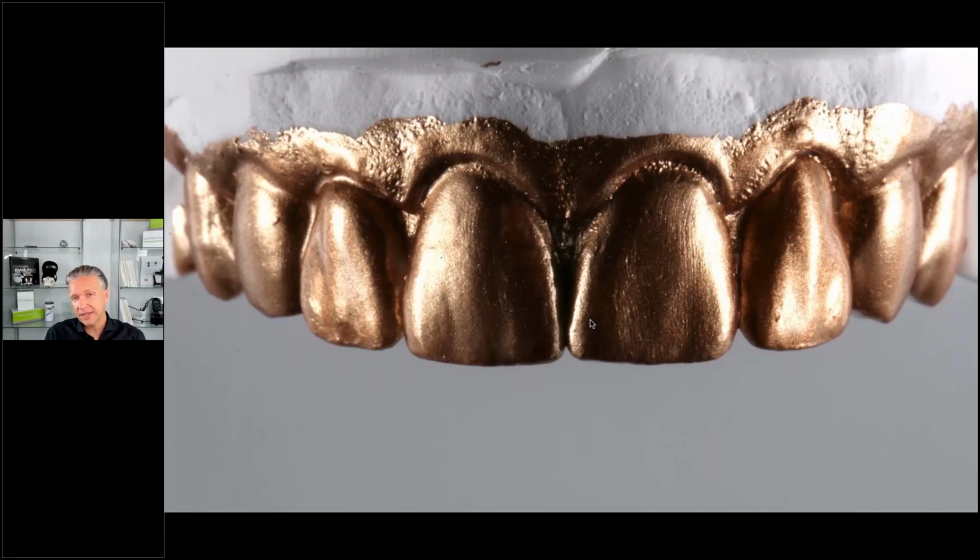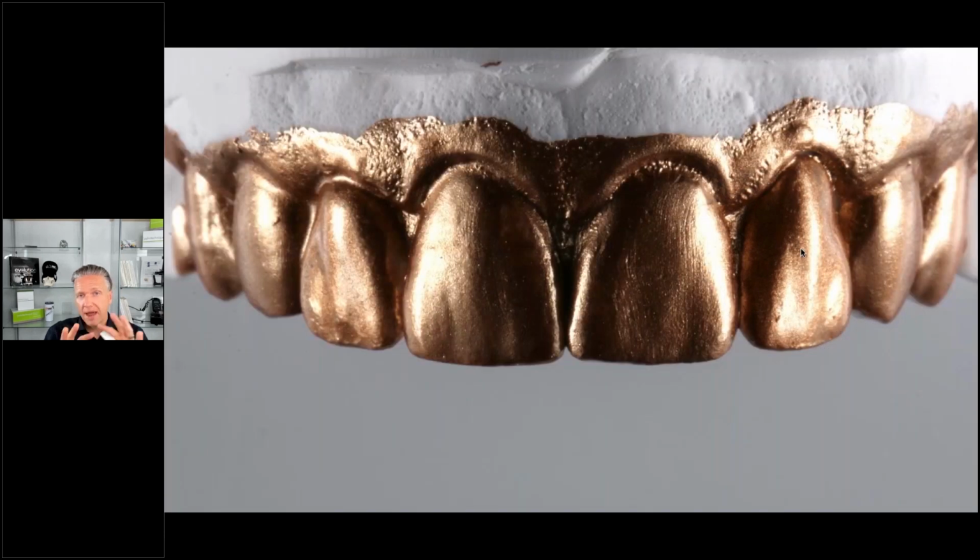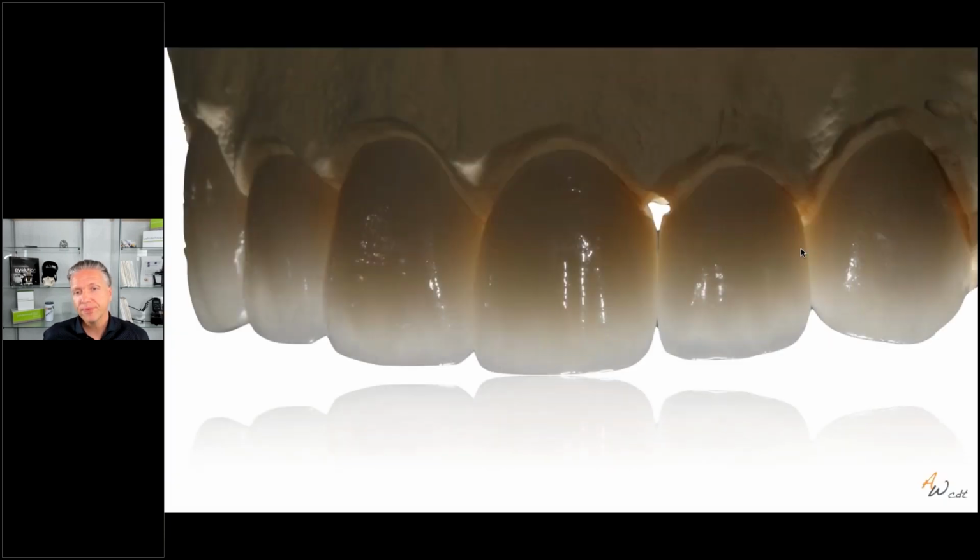I utilize, for example, these powders or these little lacquers. They're easy to steam off. They're from Harvest or from MPF, and they give me a lot of information. For example, in this case, I have 1 veneer and everything else is natural dentition, and the veneer is number 10. So I was able to really match this surface texture and line angles and everything very close to the adjacent teeth, just also with help of these little lacquers I can use there. It's really cool tools.